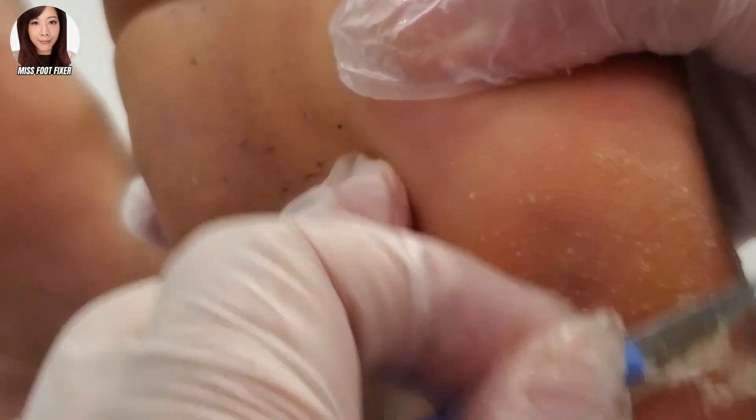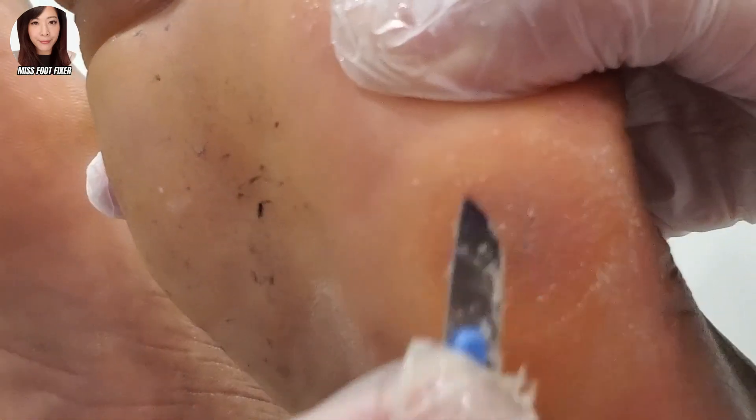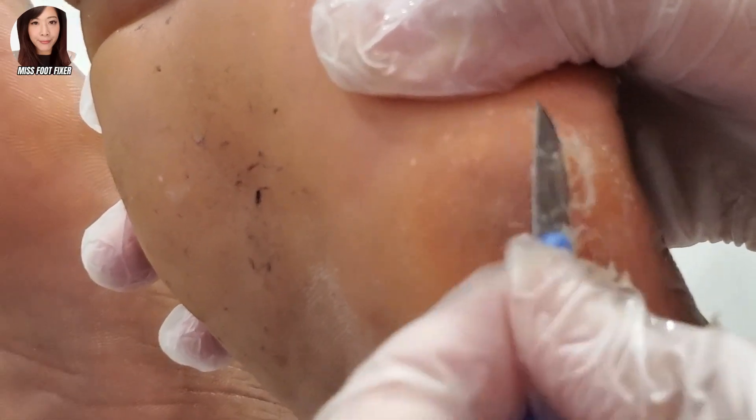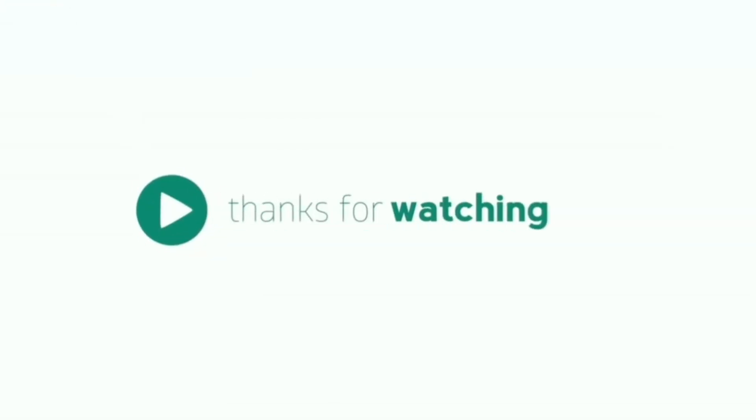Do a little bit more on the tough bits here — we're just going to remove that. Always feel it with your fingers to make sure it is even, because sometimes you can't see the difference, you need to feel the difference. Like that.